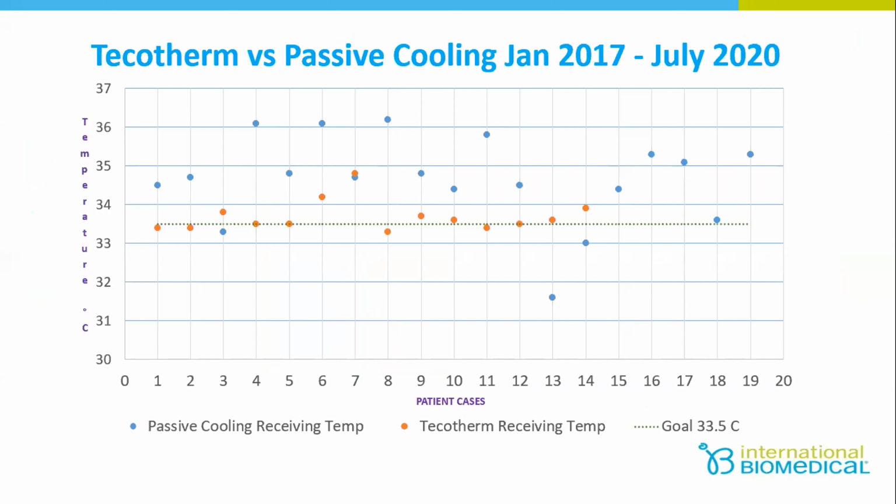One of the main things I wanted to show on that one was that there really wasn't any learning curve. We were a team that took a lot of pride in our ability to passive cool to the best of our ability. I believe we were always doing a very good job, and we were very conscious about it. But even with many years of experience of passive cooling, you can see really quickly the consistency and the ability to maintain temperature. These are all arrival temps, from the time we picked up the baby to when we arrived at the higher level of care to continue therapy. And the very first time we did it, we were spot on right at 33.5.